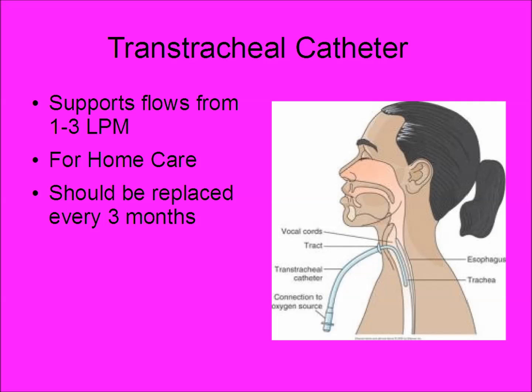So some other things is it does conserve O2 for the patient, because you're bypassing the upper airway, bypassing a lot of dead space, and that may be an advantage to it, but it's just not really commonly used in the clinical setting.